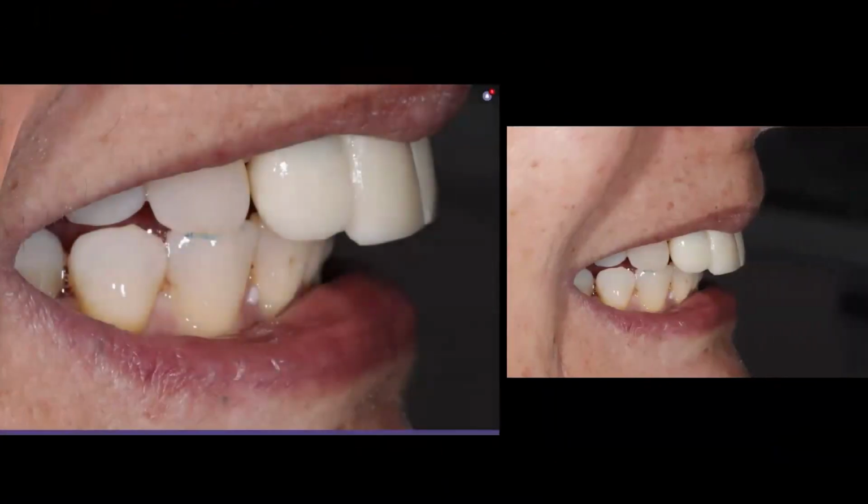So I just went off my jaw scan and the frontal view picture, and I tried in my temps after the surgeon extracted 8 and 9, and I turned Karen into Bucky Beaver. So this is a fail for me. At this point, I was like, okay, I need to bring in my face scan because I need to see how far out Karen's jaw actually sticks.